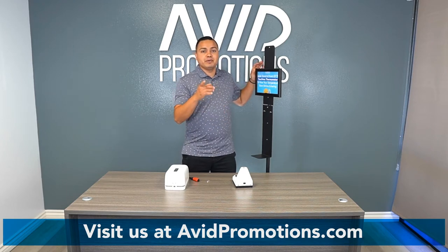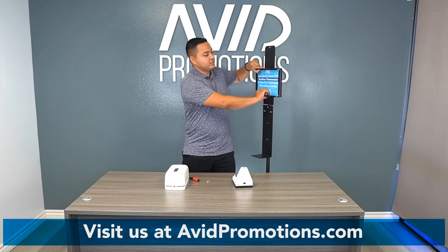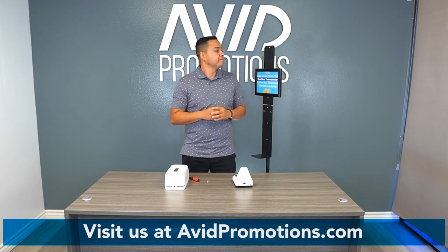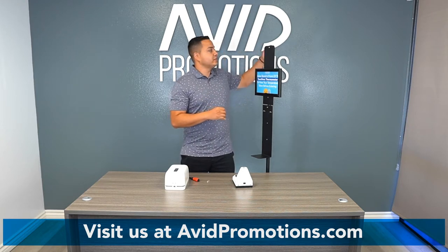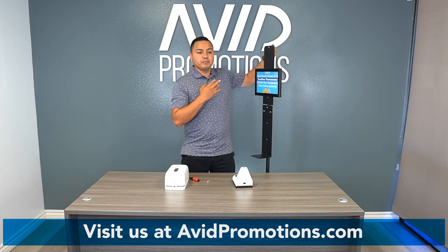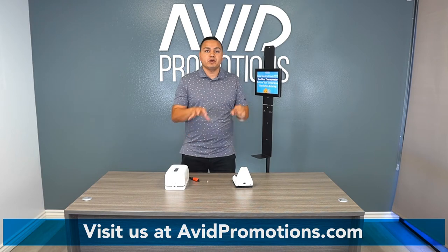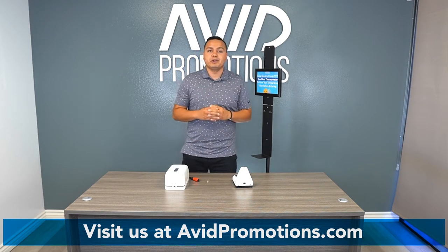Next up would be the signage. Keep in mind that it is interchangeable. Unclick them, put your signage in with your message, and leave it right there. Next is inputting the screws — one for the thermometer, two for the dispensers. Leave them a little bit loose, because once you place the two items, you'll tighten them right up.